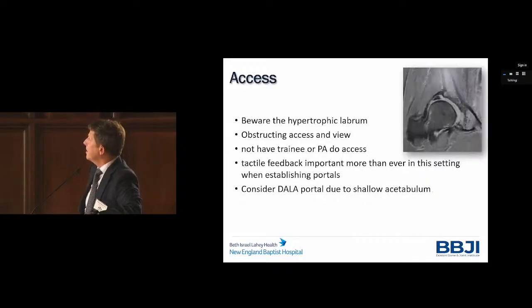Basically, you want to beware of the hypertrophic labrum, because it obstructs your view. Not everybody obviously has a hypertrophic labrum in dysplasia, but it can obstruct your view and access. So I would probably not have one of the trainees or PAs do access in this setting. You want to really harp on that tactile feedback here. You want to feel what's going on once you go through the capsule, where the needle is. You want to have a good sense and feel for that.